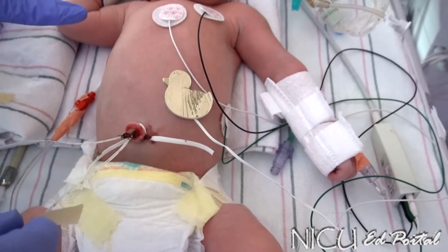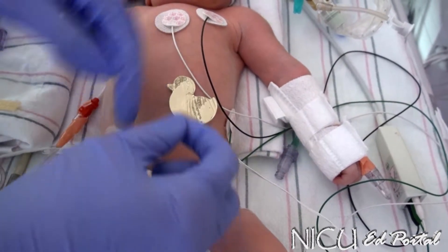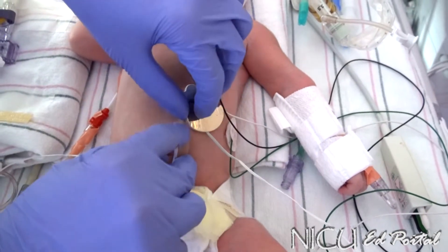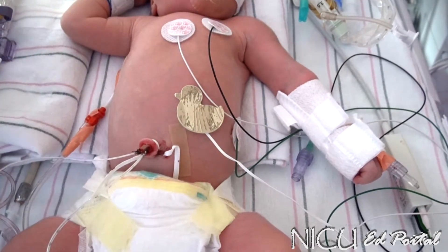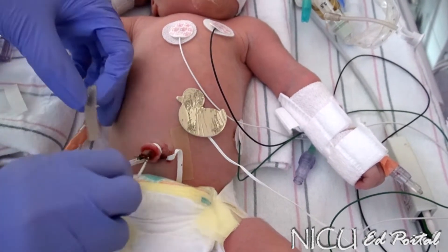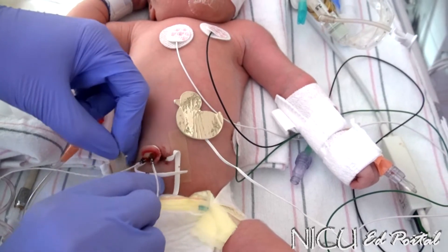For full-term babies, we don't usually use a lot of duoderm. It's more for preemies that we put the duoderm down, but it does protect their skin, so we do put a strip on each side. We definitely put the duoderm when it's a baby under 30 weeks because their skin is just so fragile.